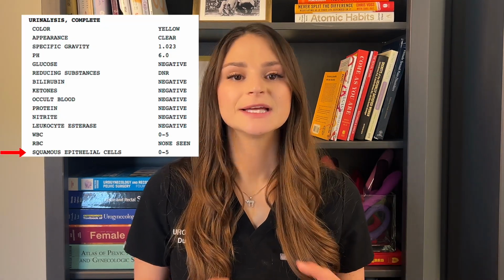Squamous cells. It's actually a good indicator of how clean your clean catch actually is. When it's positive, it doesn't mean that there is any dangerous condition going on. It's just a sign for us to know that there was some contamination. Because squamous cells are cells from the vaginal discharge and surrounding skin. And in the case when it's positive, we should wait for the confirmatory test with urinary culture and sensitivity to determine if there is any clinical significance for the squamous cells.